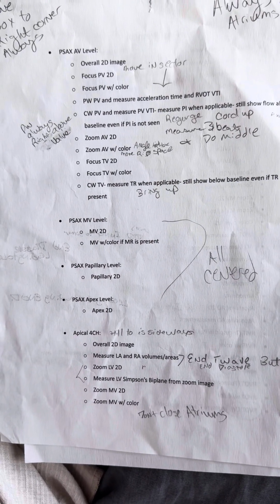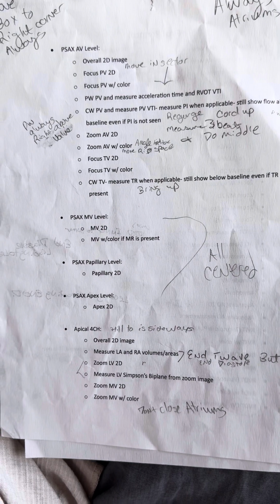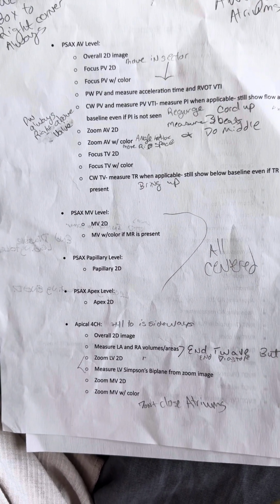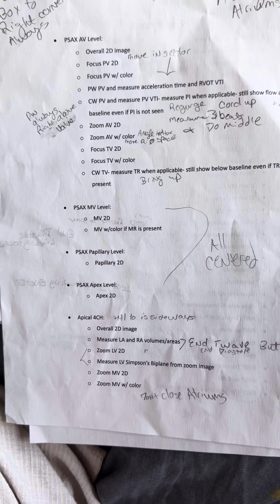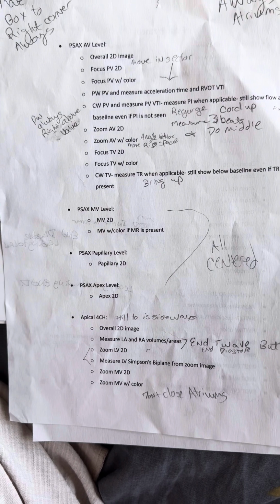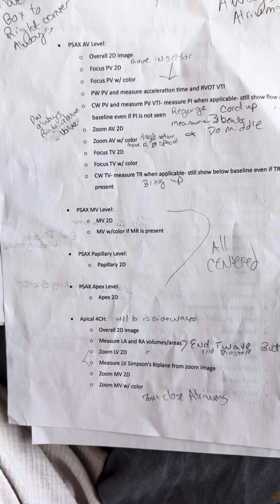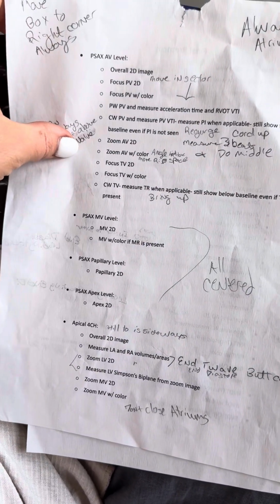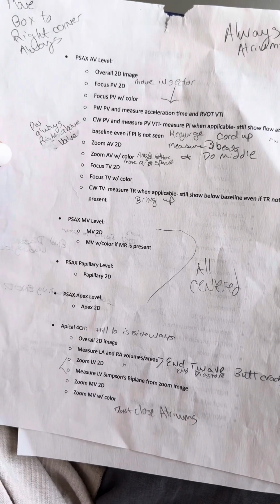Come out of just the left ventricle and get your mitral valve. Make sure to get atriums. Do not close atriums. And zoom your MV with color.